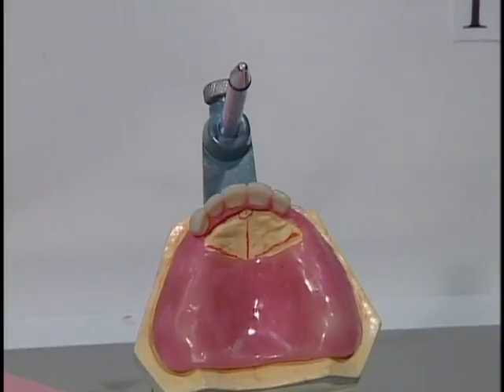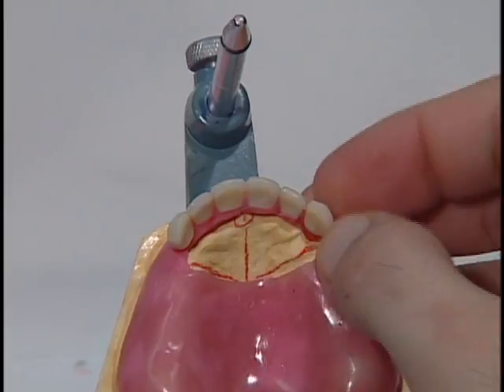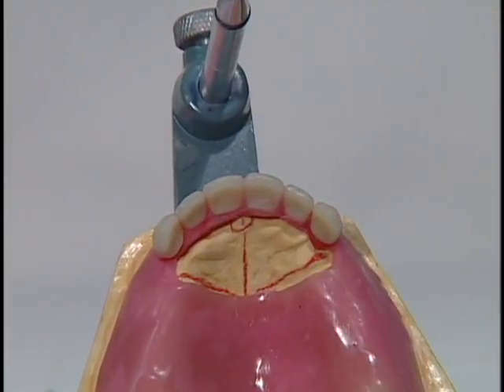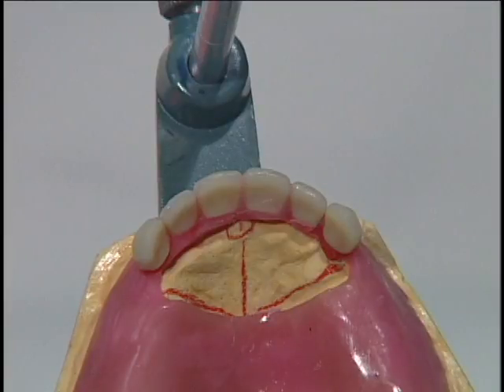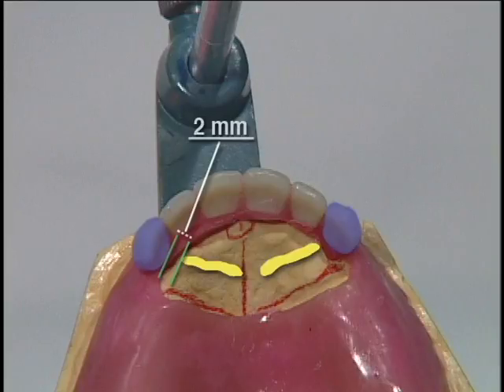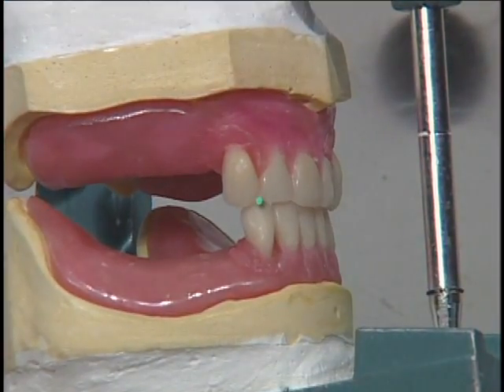There are also landmarks on the upper palate that provide clues for the proper placement of canines when lots of teeth are missing. Posterior to the incisive papilla, the first pair of long rugae point to positions on the residual ridge where the canines should go. On average, the most lingual aspect of the canines should be about 2 millimeters away from the ends of these long rugae. Place the lower canines so they occlude between the upper laterals and canines.